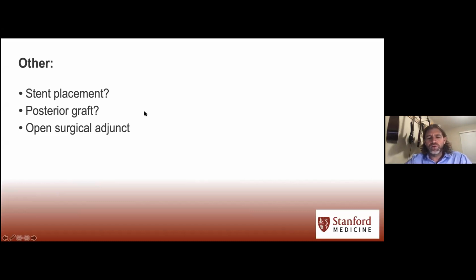Then when you're doing posterior rib grafts, if you're ever struggling, you're doing this endoscopically and you've got one flange in and one flange that wants to go in, but it's not quite there. One of the fastest things you can do is just slide a balloon in, lift the balloon up, and it'll pop the posterior graft in. Again, you've got to size it appropriately, be planning for other problems. I always tend to have a suture on the piece of cartilage ahead of time so that it doesn't run away from me.